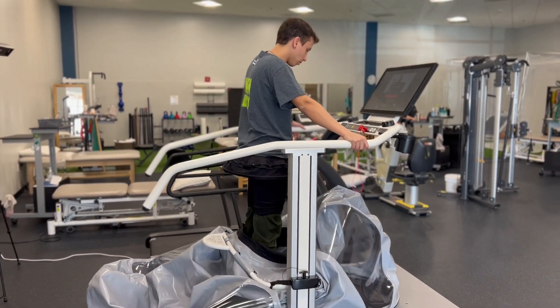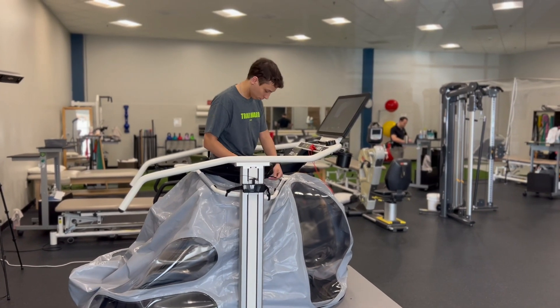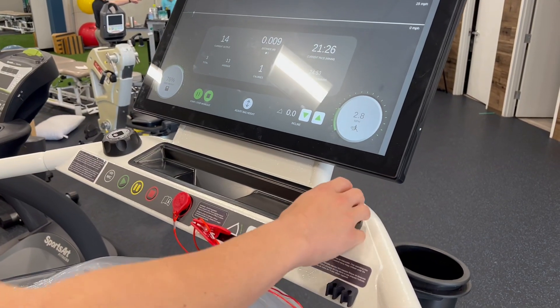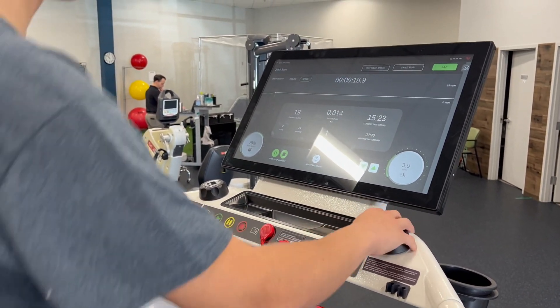There are also some impressive features that make the Boost much more user-friendly than other units we've tested, including a motorized lift system where the patient enters their body weight and Boost automatically lifts to a height personalized for them. There are also knobs for quick and easy control of speed and body weight — no tapping on the screen is needed.